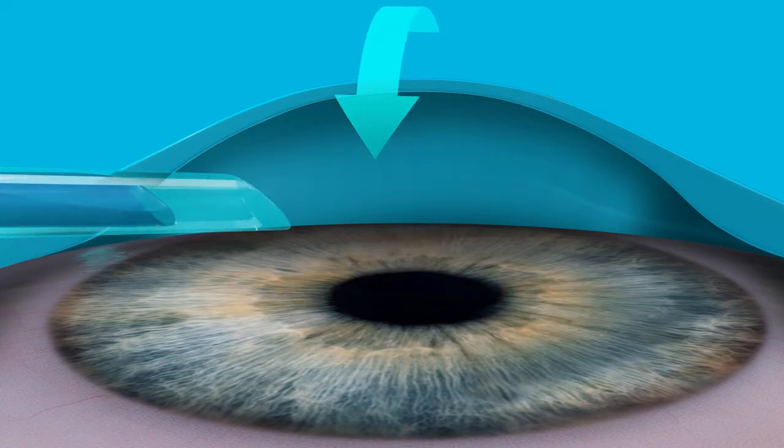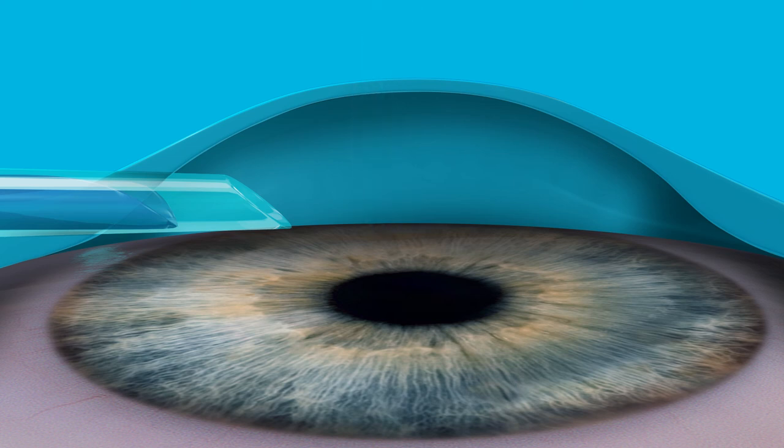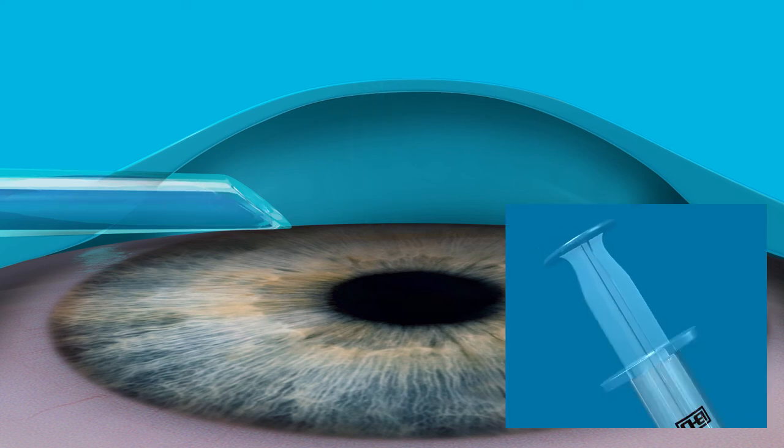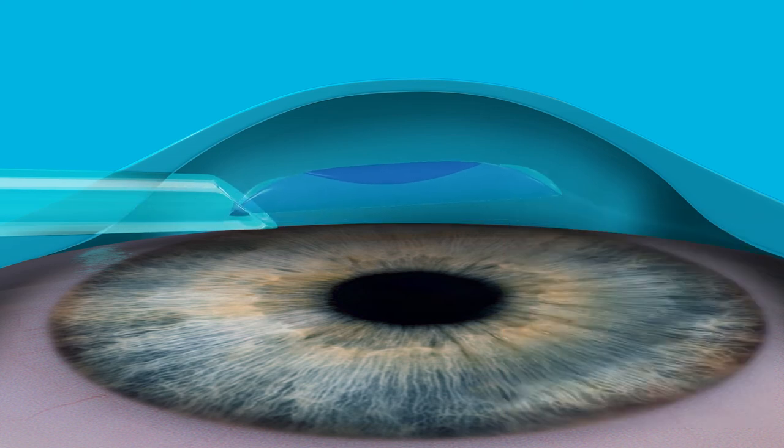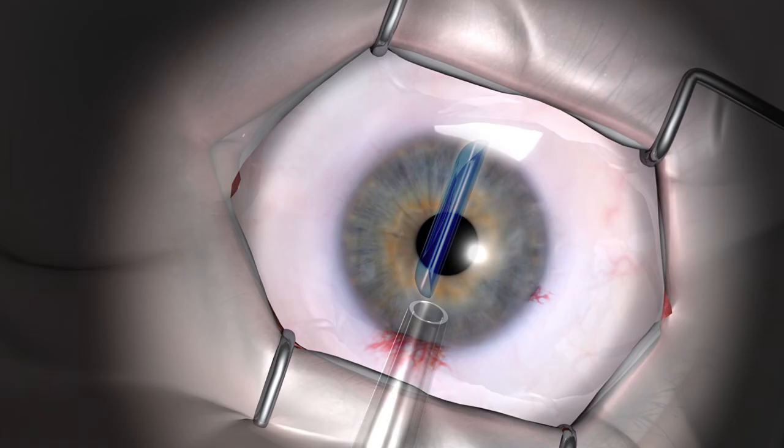Rotate the cannula so the bevel is up. Deploy the graft by gently depressing the syringe plunger in short bursts versus a steady push. Visualize the graft as it moves into the anterior chamber.